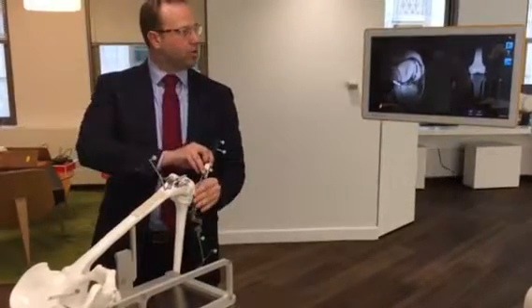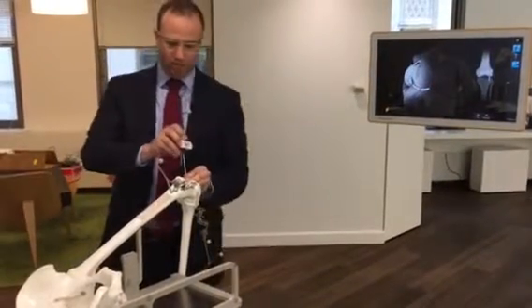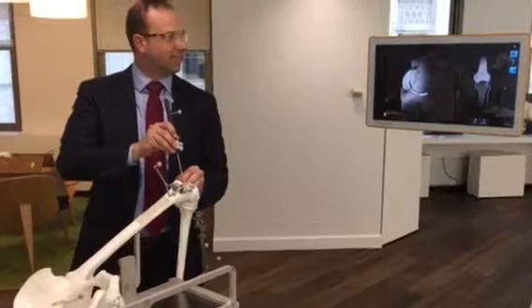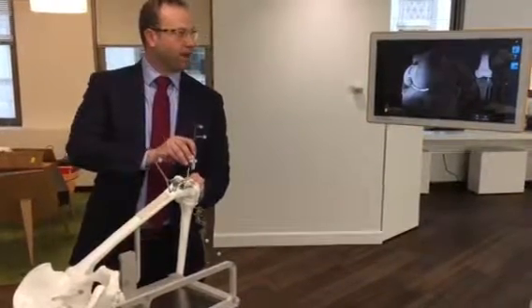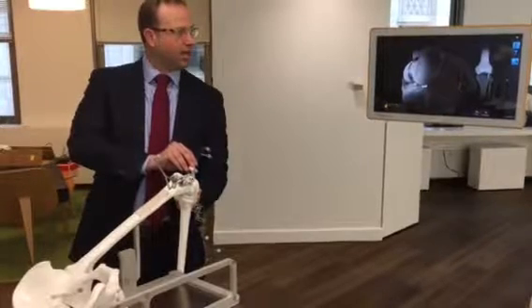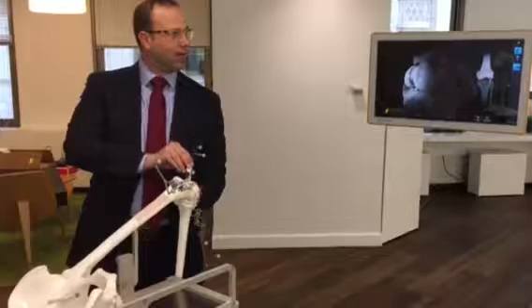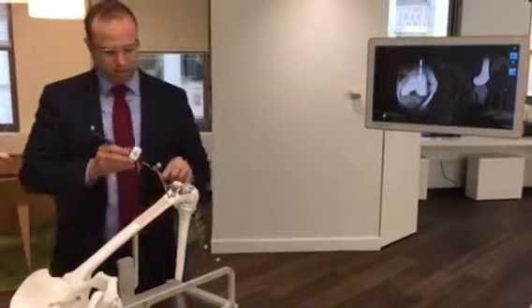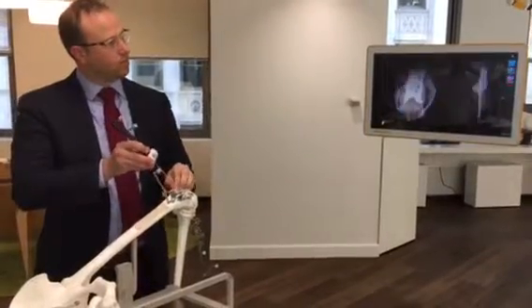As I go through, I press once on the clicker and just work through these tic tacs here. If I want to take a longer registration, I can stay in each zone much longer and gather much more data. This will just be reflected back on the screen later. And I work all the way in posterior and then forward, just making sure to grab every one of these zones. Start up here on the ridge, follow the flange down, nice and quick.